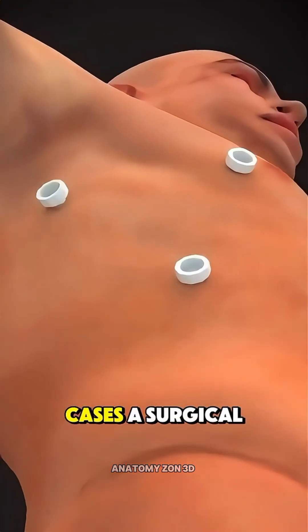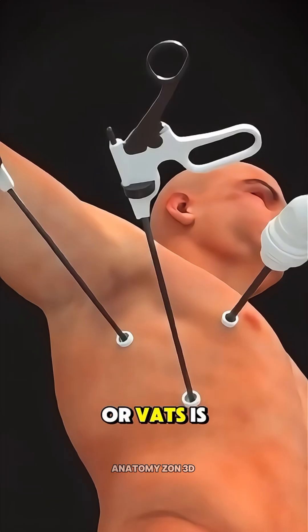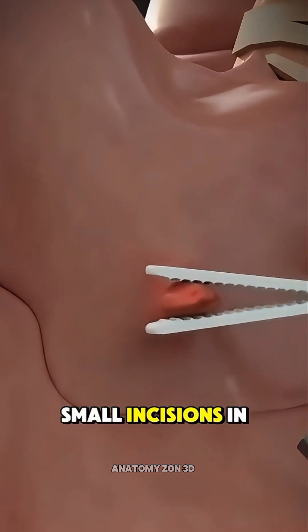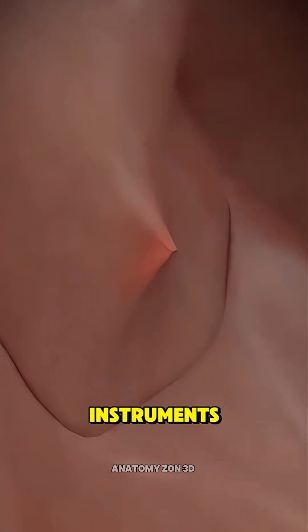In more complex cases, a surgical biopsy called video-assisted thoracoscopic surgery, or VATS, is done under general anesthesia. The surgeon makes small incisions in the chest, inserts a camera, and removes the sample using special instruments.